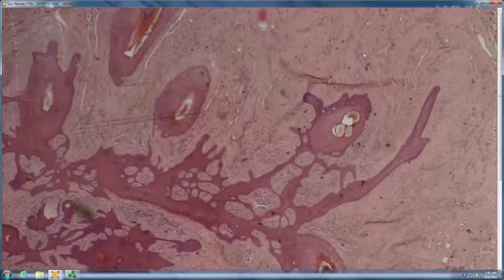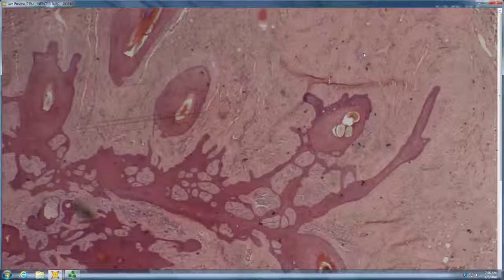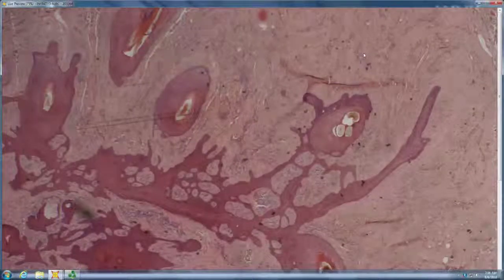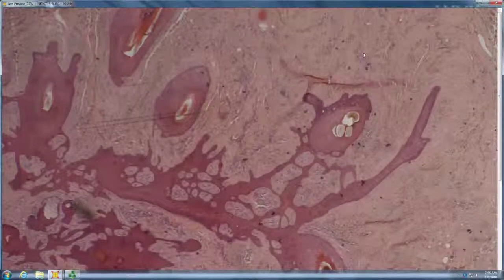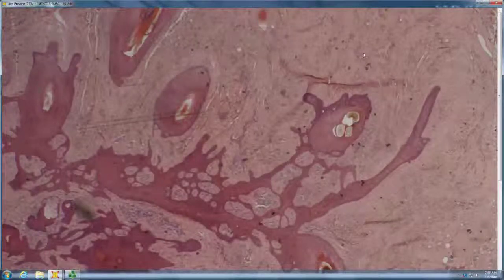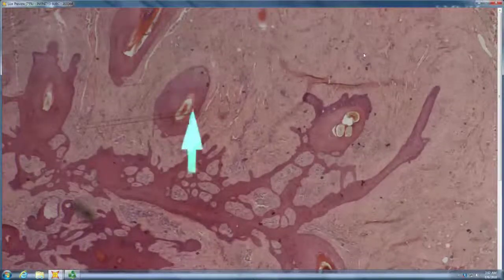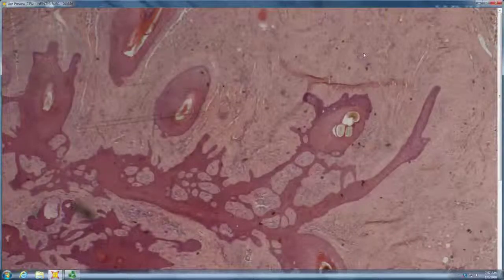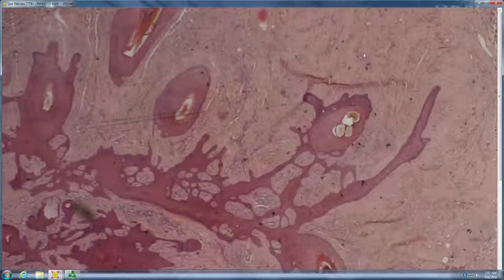So if these are all fully formed follicles, the trichofolliculoma? Yeah. So if it's fingers of fully formed follicles forming follicular fibers, then it's the folliculoma. Right? Okay. So fingers, fully formed follicles, folliculoma, to help you remember that. So trichofolliculoma has the fully formed follicles and they form follicular fibers, so they're making hair. Right? Clinically, it's a bump with a tuft of hair coming out of it.